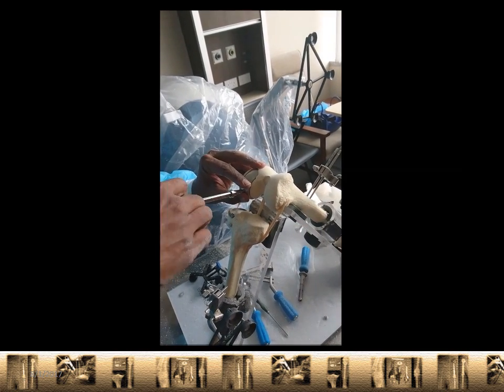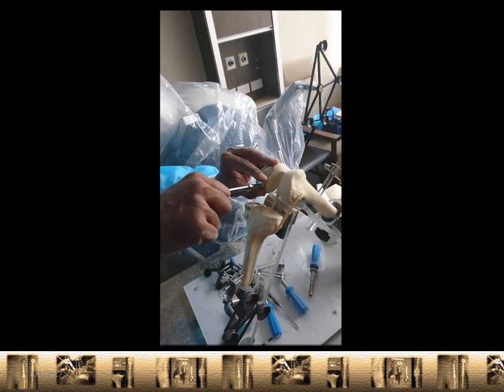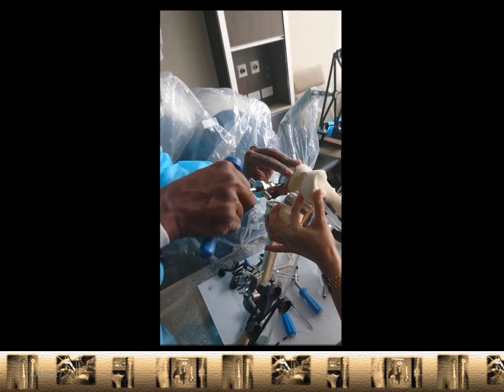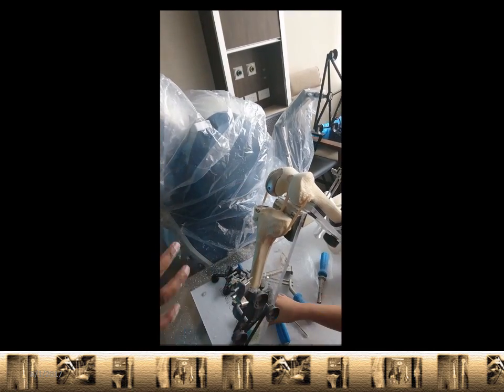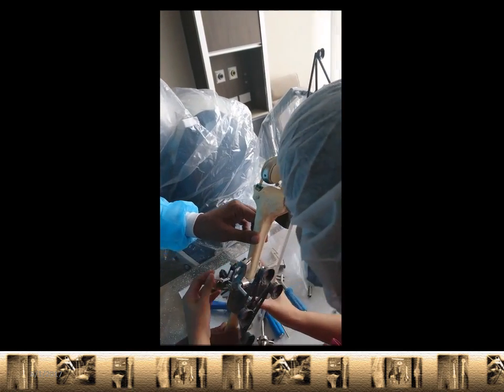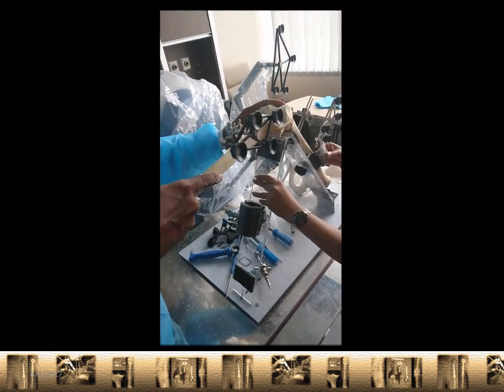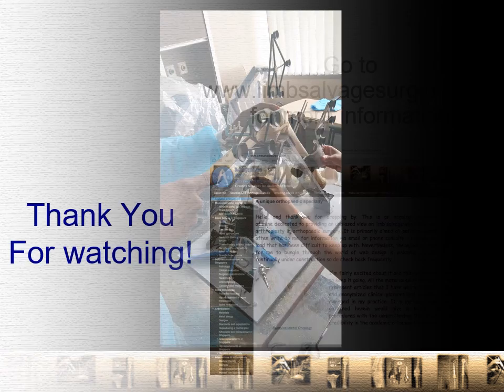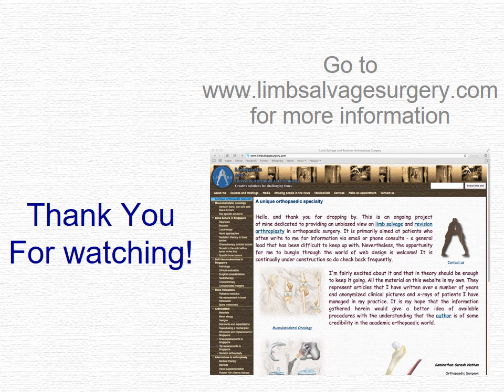So there we have it — a little over a minute of a Makoplasty knee replacement using Sawbones. But essentially, these are the steps that we take when we do one of these procedures on a patient. In a minute, that's me putting in the plastic spacer, my assistant giving me a hand — and done. So thank you very much for watching. Please do go to www.limbsalvagesurgery.com for more information, or you can look us up on Facebook or on YouTube. Thank you very much.